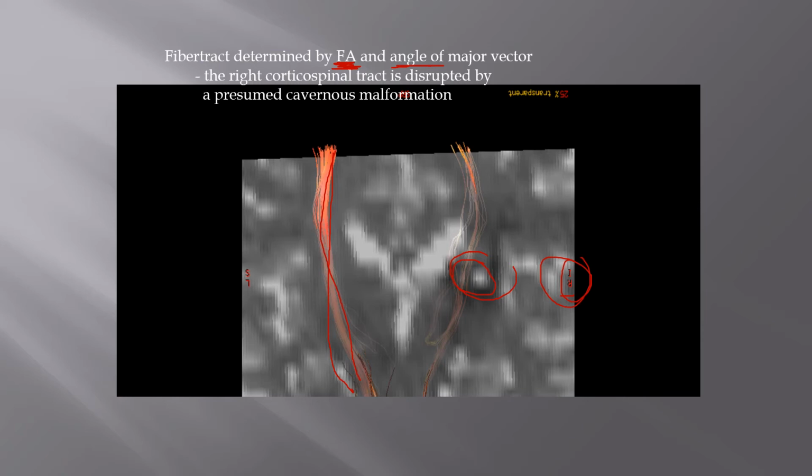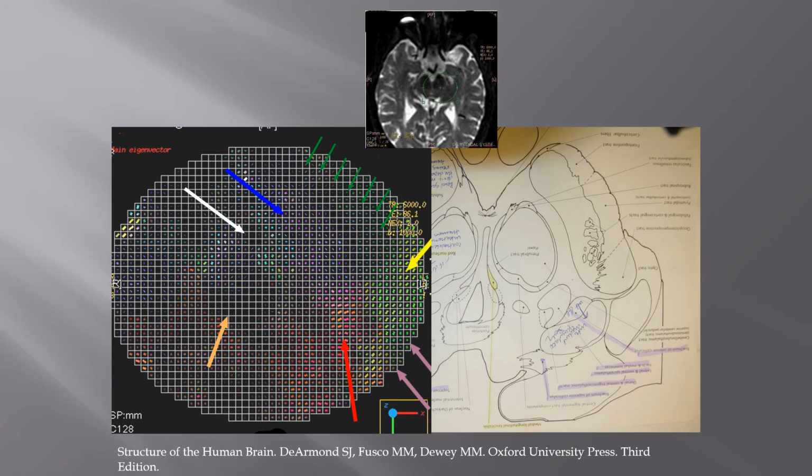So, surgical resection was not attempted since this lesion is infiltrating the white matter tracts, not just displacing them. Even if it's displacing them, resection would be risky since the tracts would be right up adjacent to this lesion, which presumptively is a cavernous malformation, a benign lesion, but they can continue to hemorrhage and cause problems with the adjacent white matter function.